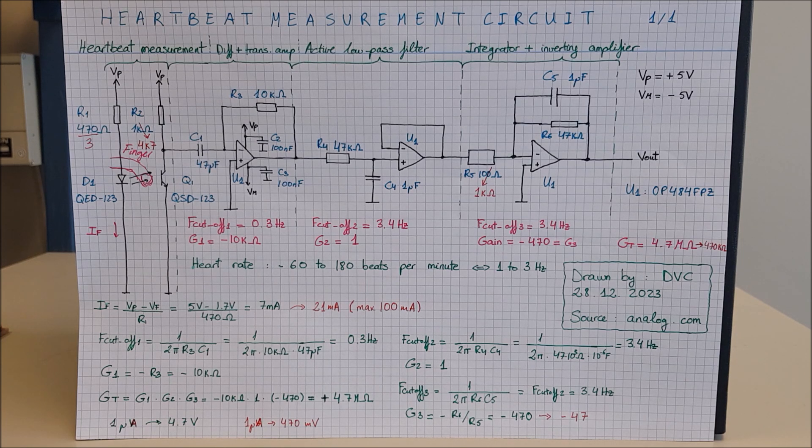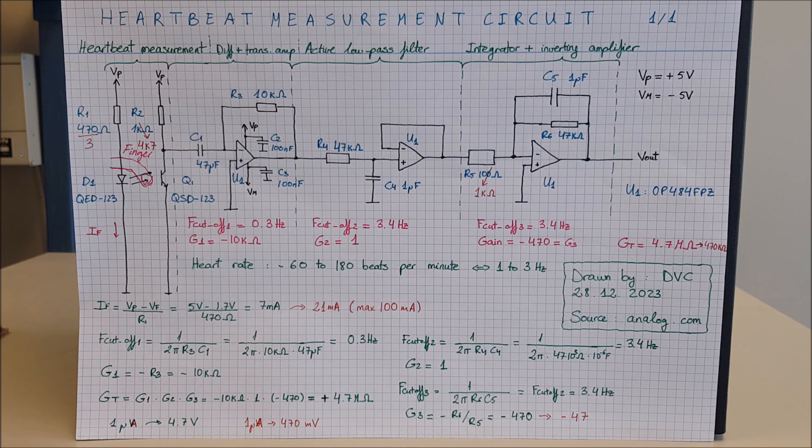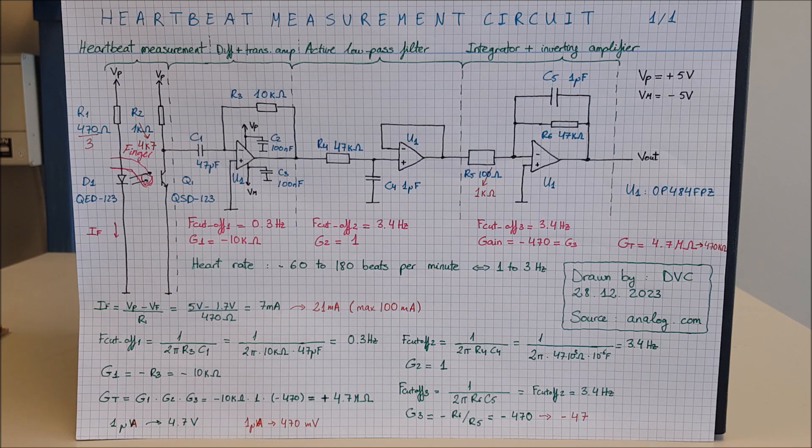The way we measure heartbeat is by shining infrared light through a finger. Infrared light has the highest penetration compared to blue light and can be easily detected with a phototransistor, similar to how your remote uses infrared light and there is a phototransistor in your TV to detect it.